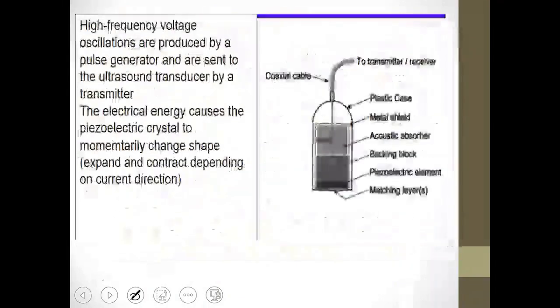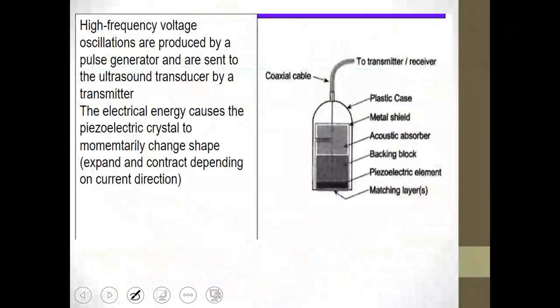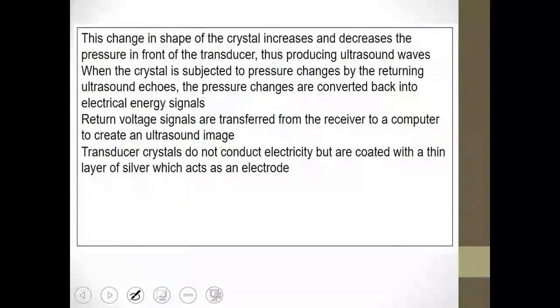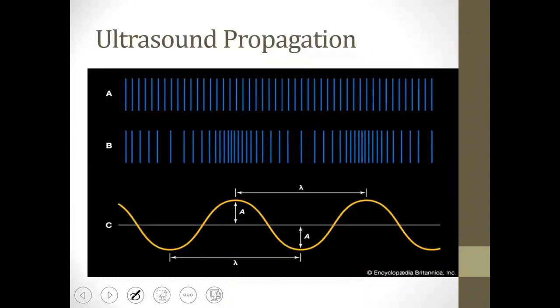Now, let's talk about the sound pulse, or the ultrasound beam, that has specific properties, a certain speed, and this speed is determined based on the media it travels through. It has a frequency, which is the number of cycles per second, and a wavelength, which is the distance between two crests or two troughs, and it has a certain amplitude. The amplitude represents the highest energy or the highest pressure present. You see the area that is considered the region that expresses this.